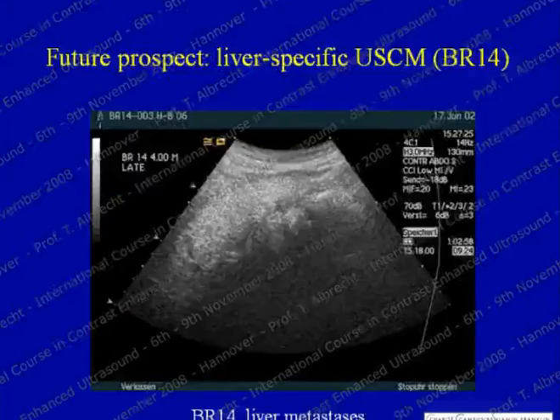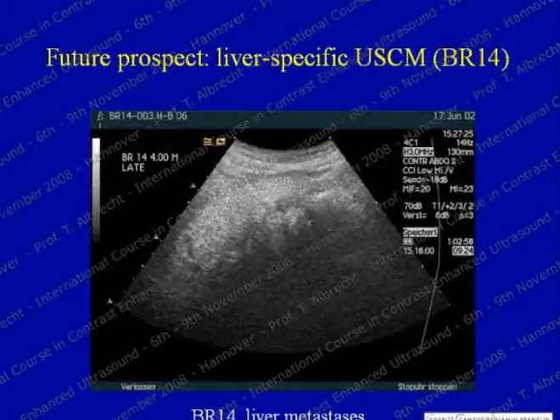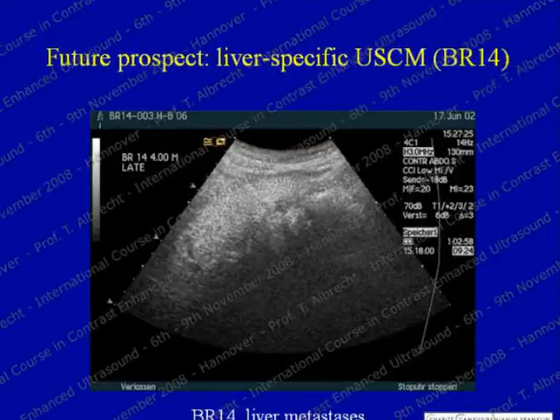Just to show a future prospect: this is a truly liver-specific low-MI agent for liver imaging, BR14. You can see during the delayed phase these punched-out lesions. This really is the sort of image quality we would like to see with every contrast-enhanced case, but it is not currently available. It would be great if industry could provide such new tools.